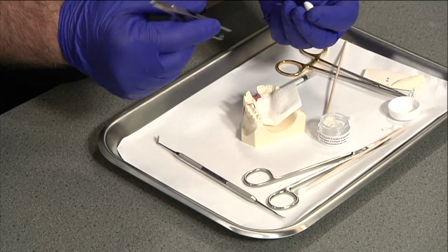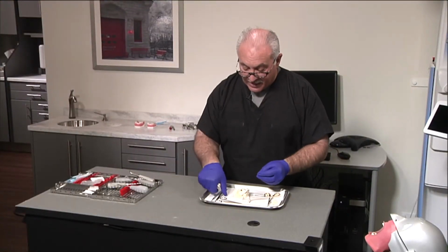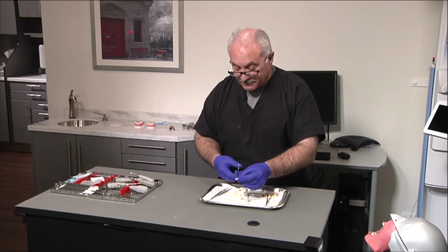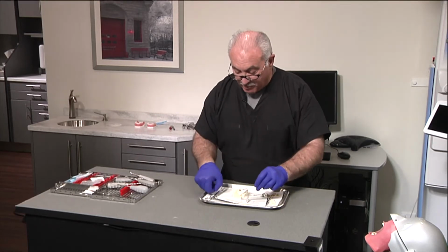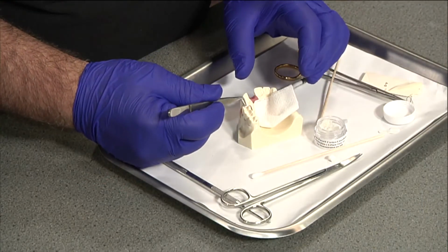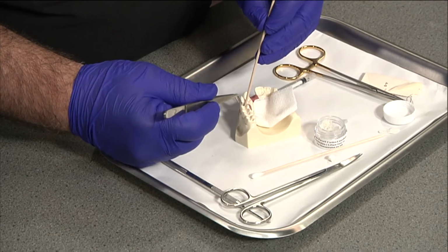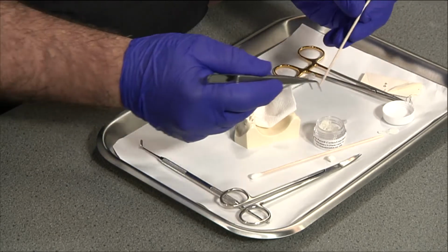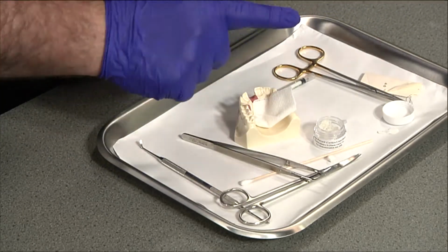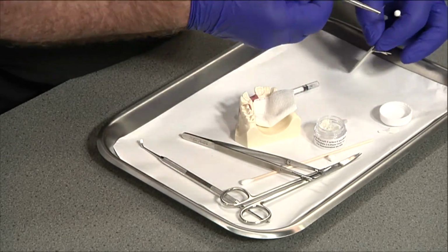And then the collagen plugs come cut in half, so you'll cut it maybe in a third. Pardon me fumbling here. And then you'll place it over the socket. Here's where your assistant comes in handy, because once it gets wet with tissue fluid and the saline, it can slime. So now I've placed 2 interrupted sutures in an X pattern.